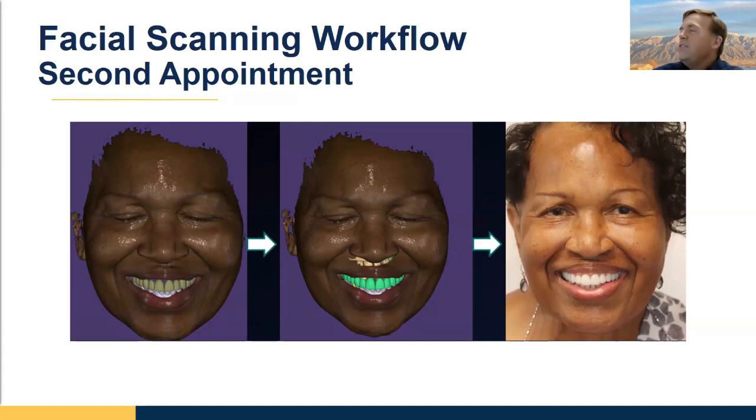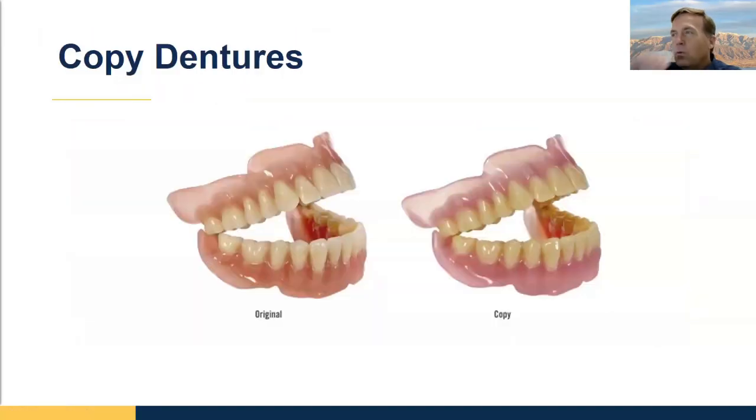So this is different than when a 2D photo is aligned to models or surface scans, because when you align a 2D photo, it's only accurate from one direction. As soon as you turn it, the relationship of the 3D IOS scan to the 2D photo isn't accurate anymore. So this is definitely a big step. Love this. If you get an opportunity to try it, I think you'll think it's cool.